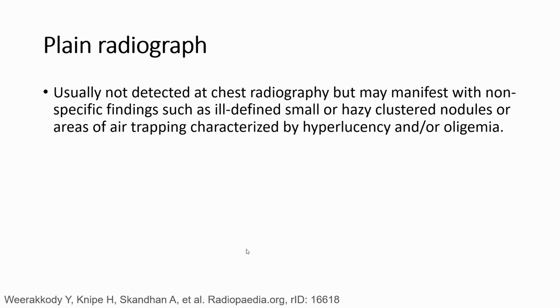In chest X-ray, bronchiolitis is usually not detected. But it may manifest with non-specific findings such as ill-defined small or hazy cluster nodules or areas of air trapping characterized by hyperlucency and/or oligemia.